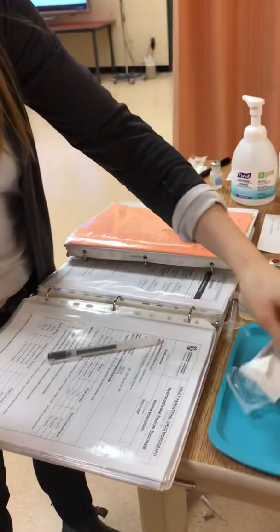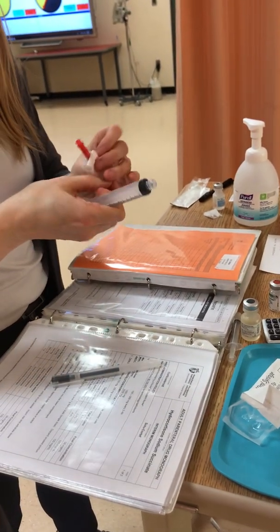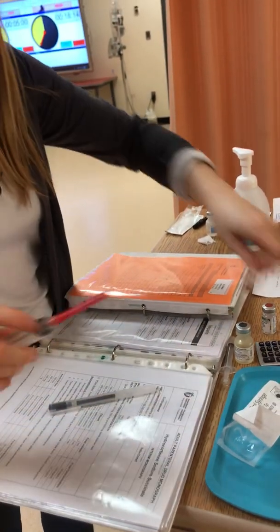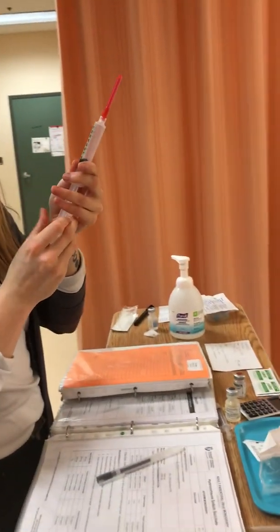So I'm going to grab my 10 milliliter syringe. Okay, grabbing 8.4.